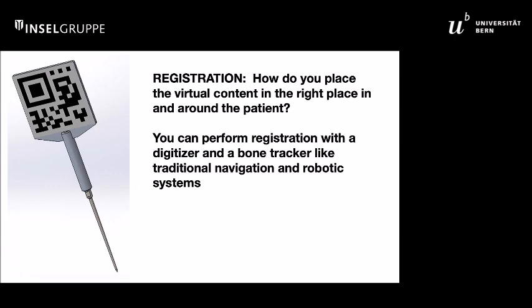How do you register? That's how you track. How would you register? Well, you can register by putting a tracker on the patient like you would with any other navigation system, and then putting information in using a digitizer.